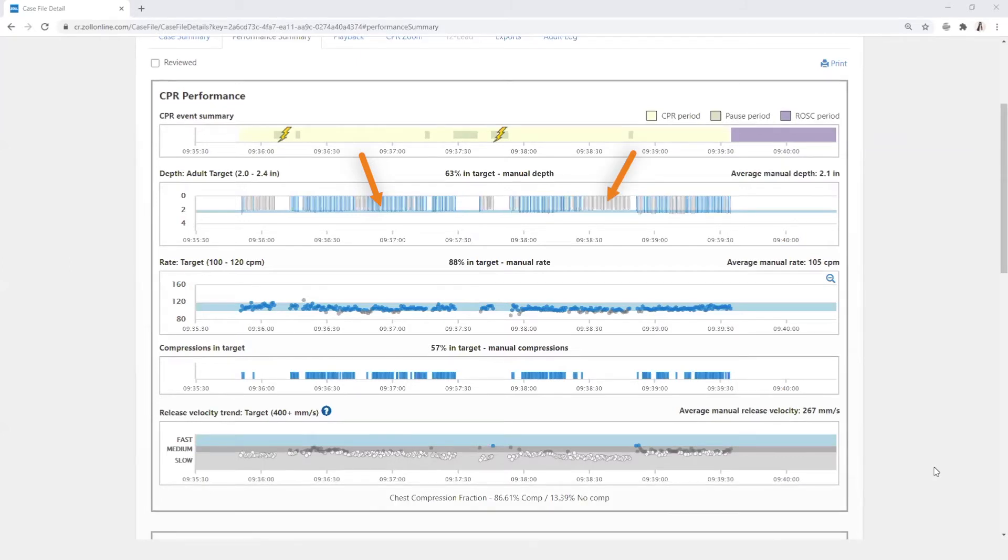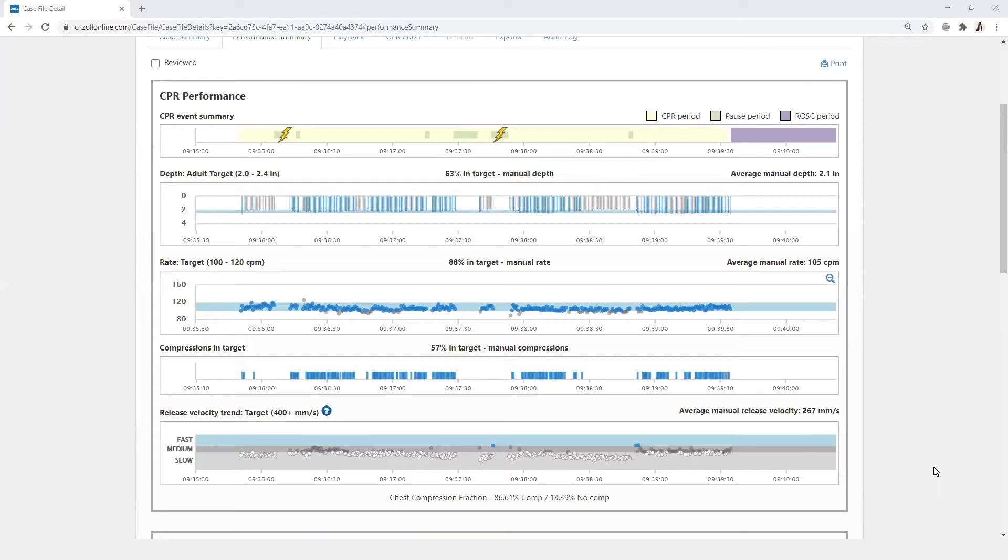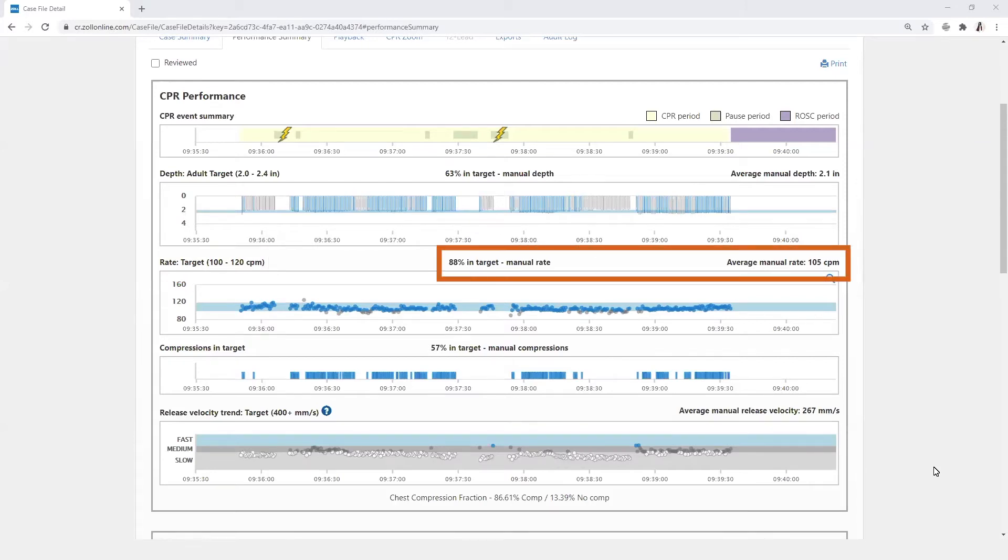Those in blue are within the target guidelines and those in gray are outside the target range. The overall percentage of compressions that meet the target depth is displayed as well as the average manual depth. The rate target is also specified and uses the same color display to identify compressions that are within the target range and those that are either too fast or too slow. The percent in target and rate average are also shown.